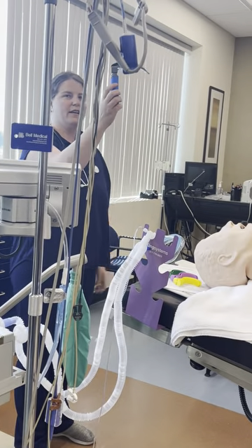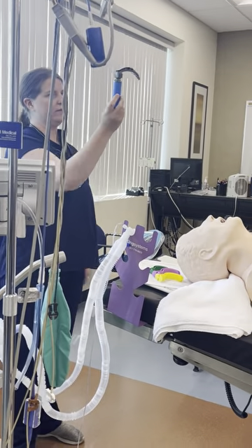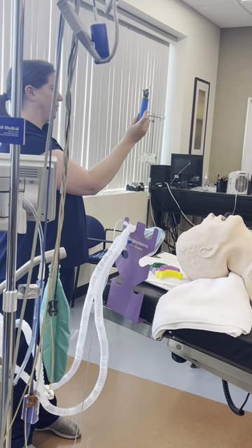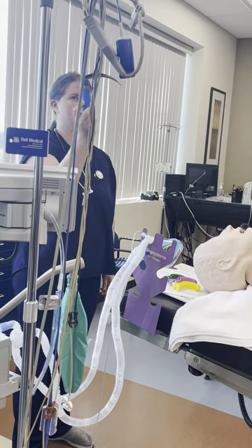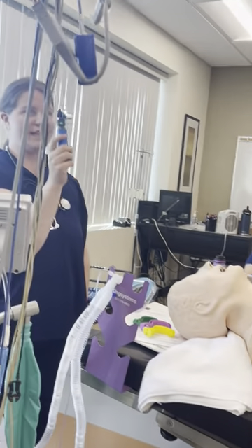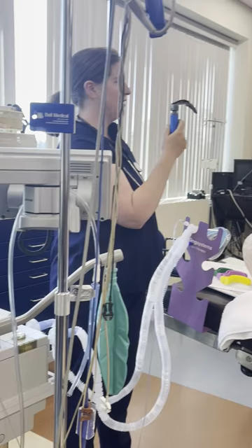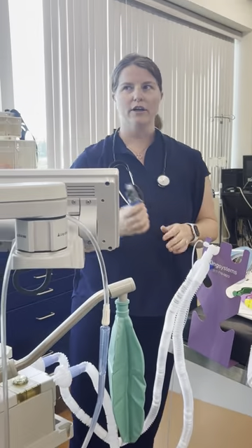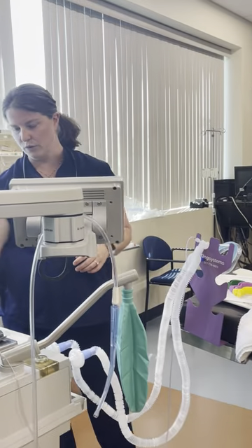This is a laryngoscope. This is a MAC blade. You can tell it's a MAC because it's got this nice curvature that follows the natural curvature of the oropharynx. The light at the end should be nice and bright — you do not want a dim light. If it's dim, either your handle needs to be recharged or you need a new handle.